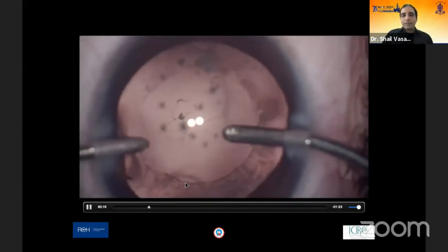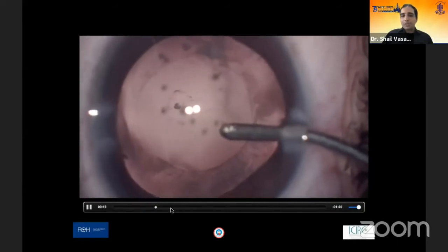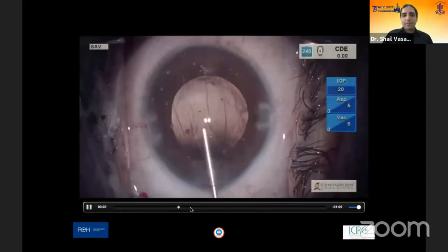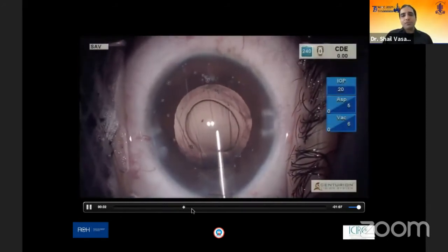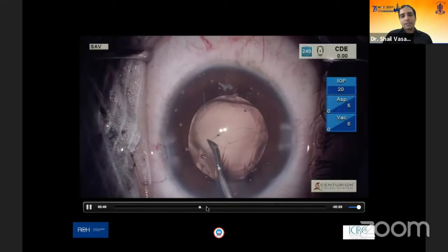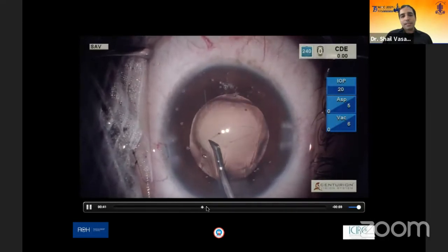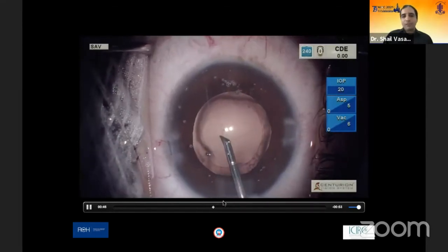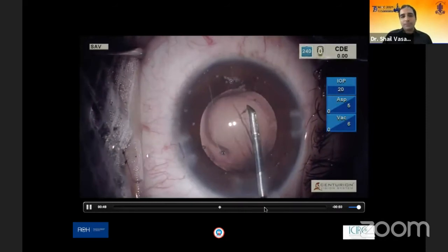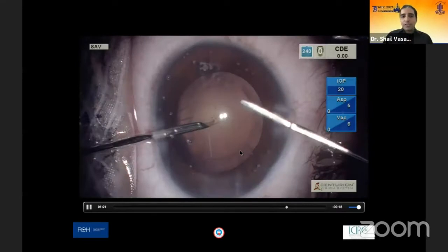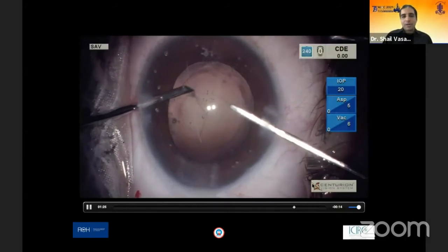At this point, the easiest mistake is to panic — do not panic, do not withdraw your irrigation. Inject dispersive viscoelastic to plug the defect so the chamber does not collapse. Since there was no vitreous disturbance, we had the option to convert this into a strong posterior capsulorhexis margin. Although we had counseled the patient about the possibility of a monofocal IOL, if we can create a strong posterior capsule margin, we can still proceed with the planned IOL.